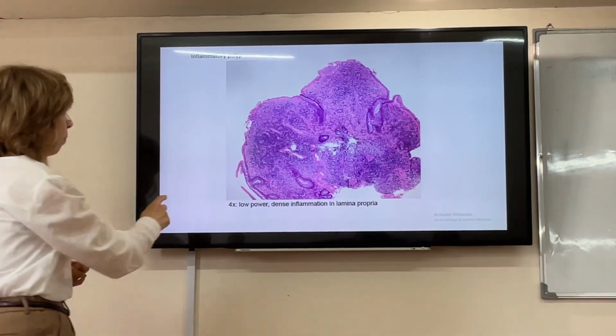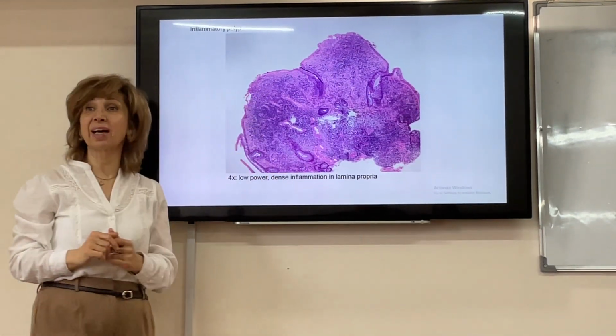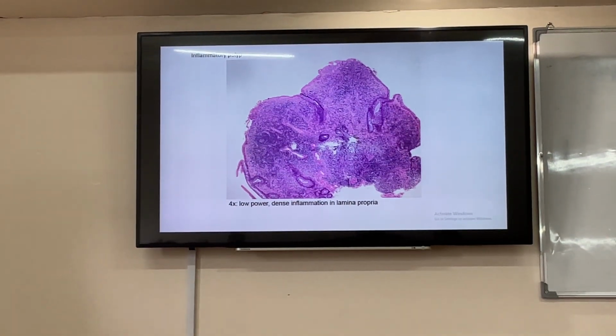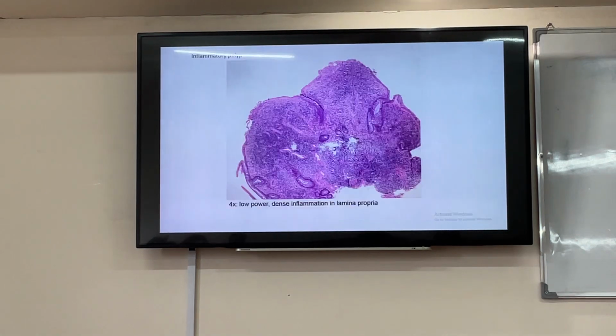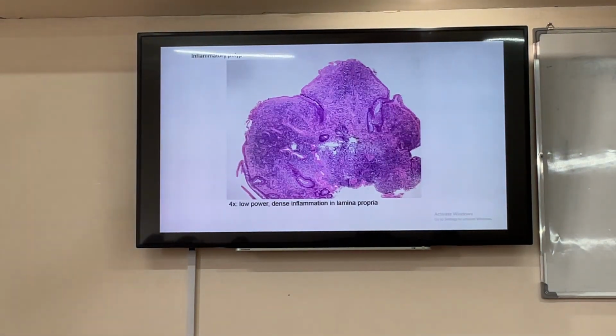Look at the epithelium. At most small erosions, but I don't see any cytological features of malignancy. I don't see any invasion, etc. I will put the second one to show you that I have colon cells with mononuclear inflammatory cells. These are together, so you tell me this is chronic inflammation. And from picture one you see it's polypoid, so you say it is an inflammatory polyp.